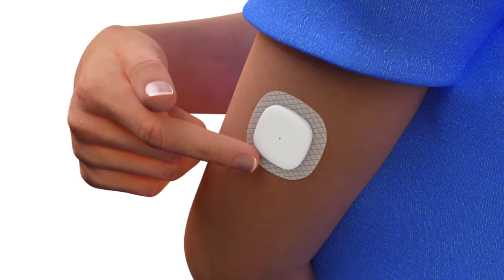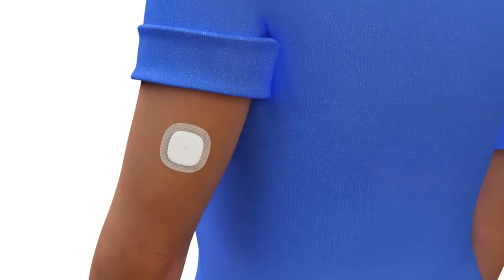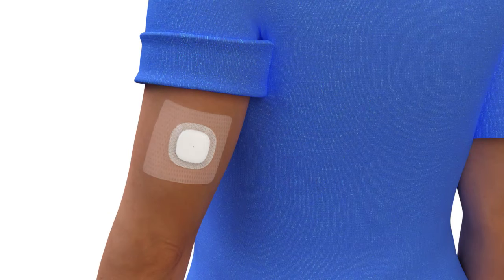Smooth down the sensor adhesive with your finger to ensure the sensor stays on the body for the entire length of wear. You may use over-the-counter tape if needed to help the sensor stick better.